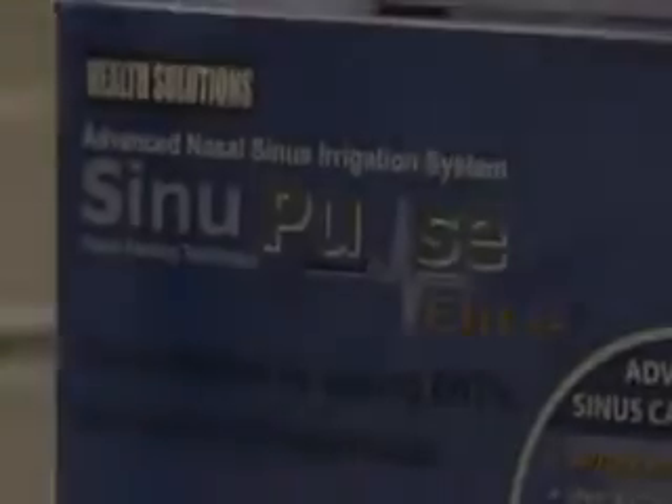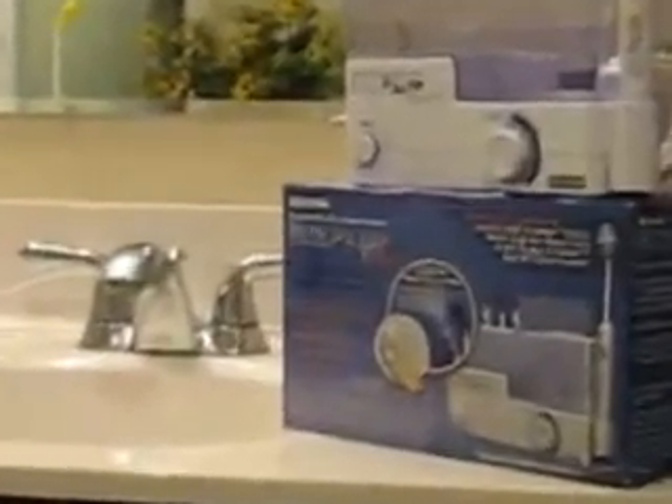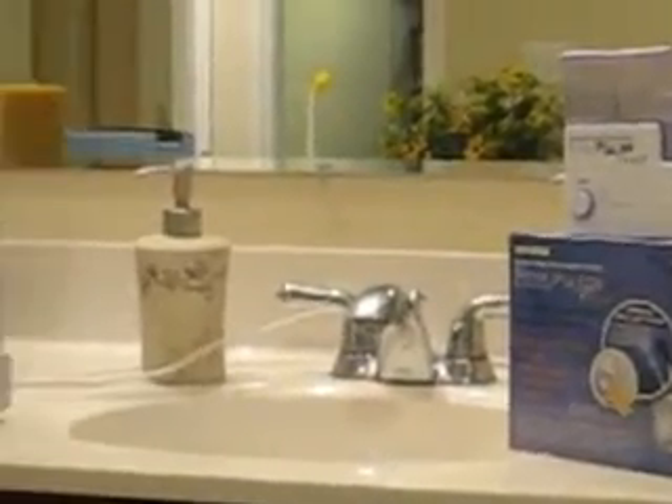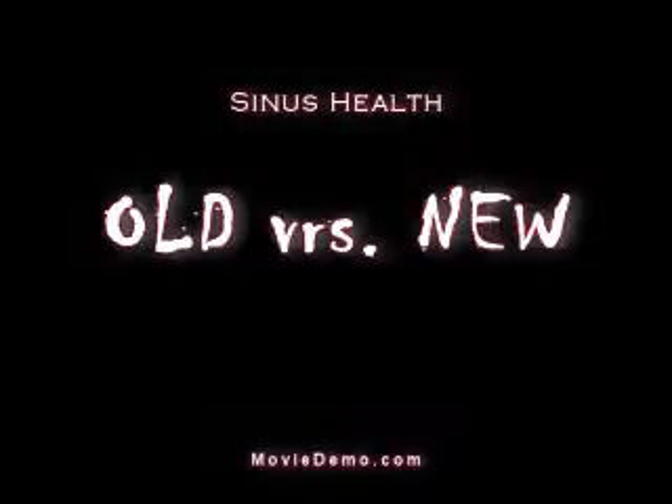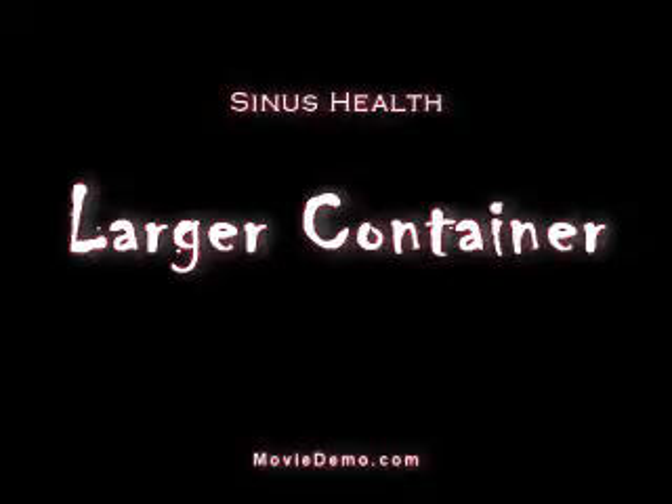We received the Sinu Pulse Elite from Health Solutions. Those of you may have seen a review we did a while back of an older unit. Old versus new: the newer one has a larger container that you're able to put a few more ounces of saline solution in when you're using it.